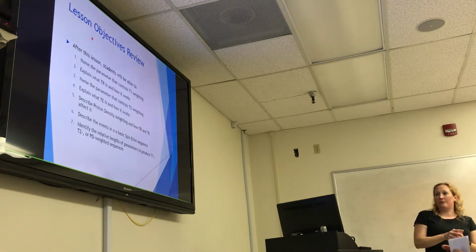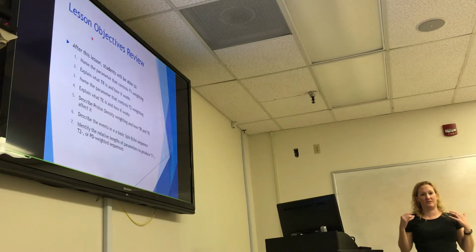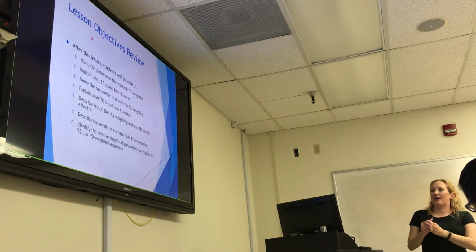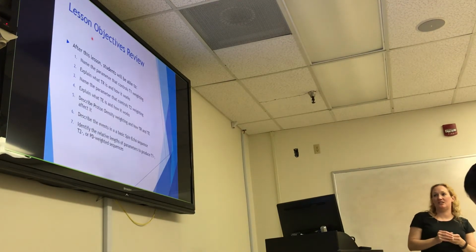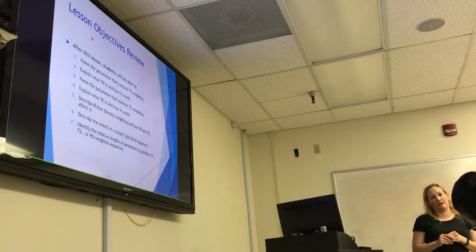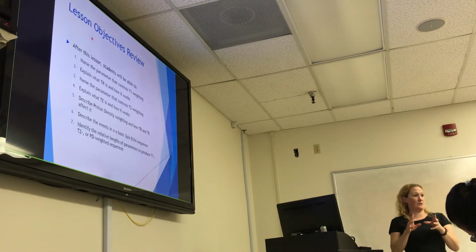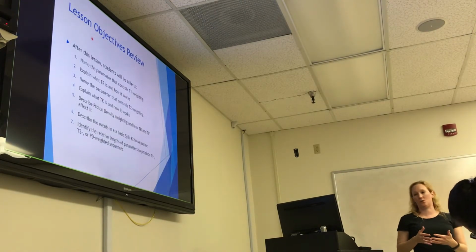And then we can describe our basic events in a spin echo sequence, and what is it? It's 90, 180, echo, right? It's just as simple as it can possibly get: 90, 180, echo. And then we can identify our relative lengths of our parameters for the T1, T2, or proton density weighted. And again, that's something that you definitely need to look at, those limits, okay? Start paying attention in clinic so that you can make those correlations, okay?